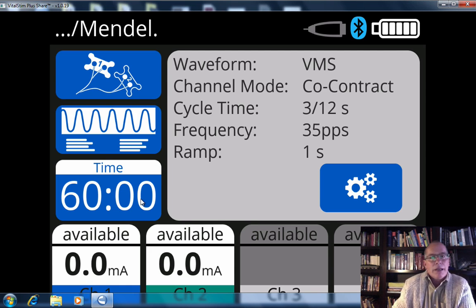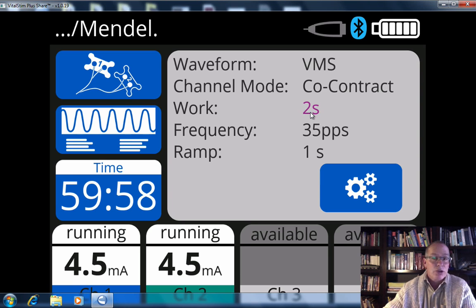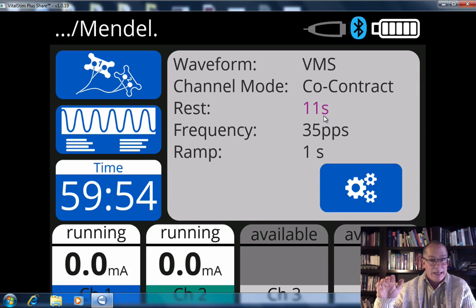Then I go up, click, click, click, click. Tell me, patient, when you feel it. Yep, I feel it. Okay, tell me when you feel the grab. It's going to feel a strong grab. Okay, there we are. Yes, boom. Okay, good. Now, if you watch the screen here, it says work 3 seconds. Very soon it will start going down. There you go. Now it's off, 12 seconds.